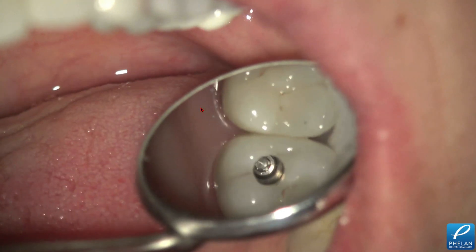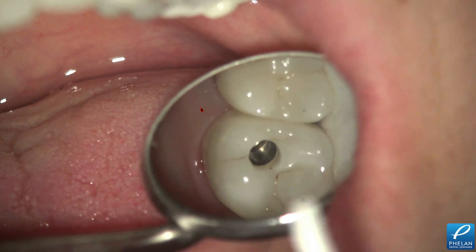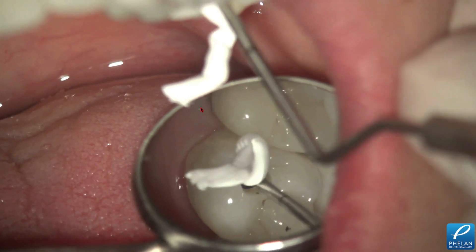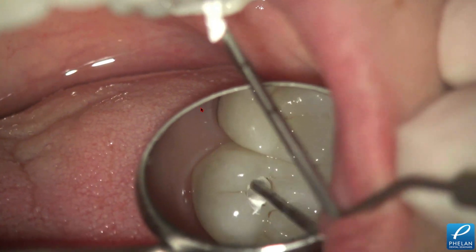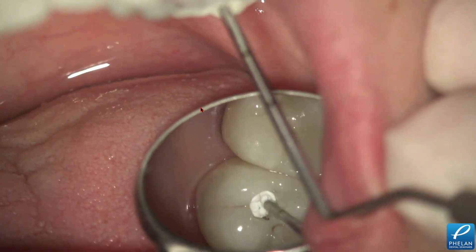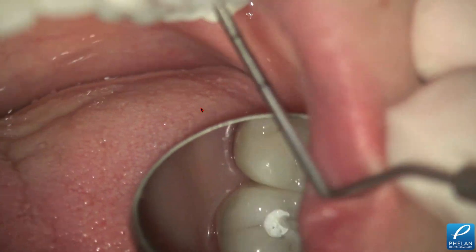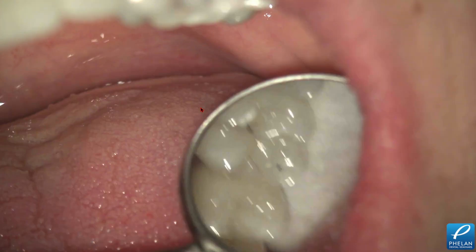Here's another case. This was a case I inserted yesterday — a full mouth or full arch rehab that Harold Heindel had done. This is an implant crown, a zirconia crown on a tie base. And there it is again, looks like way too much, but we've measured this. Now you see I'm plugging it in with that specifically designed plugger. And look at this — it's actually a good amount. By the time I condense this down, I don't have an excessive amount of space for composite resin. My bias is I'd rather have a smaller amount of composite resin in case I ever have to screw this out. That's a couple of videos I shot in my Zeiss microscope yesterday and the day before.